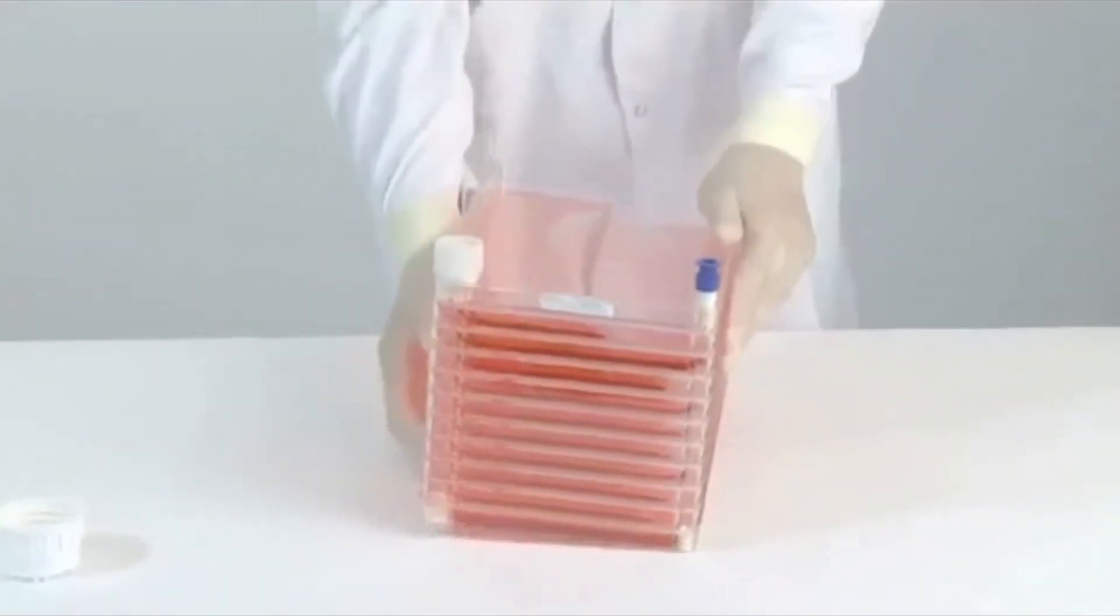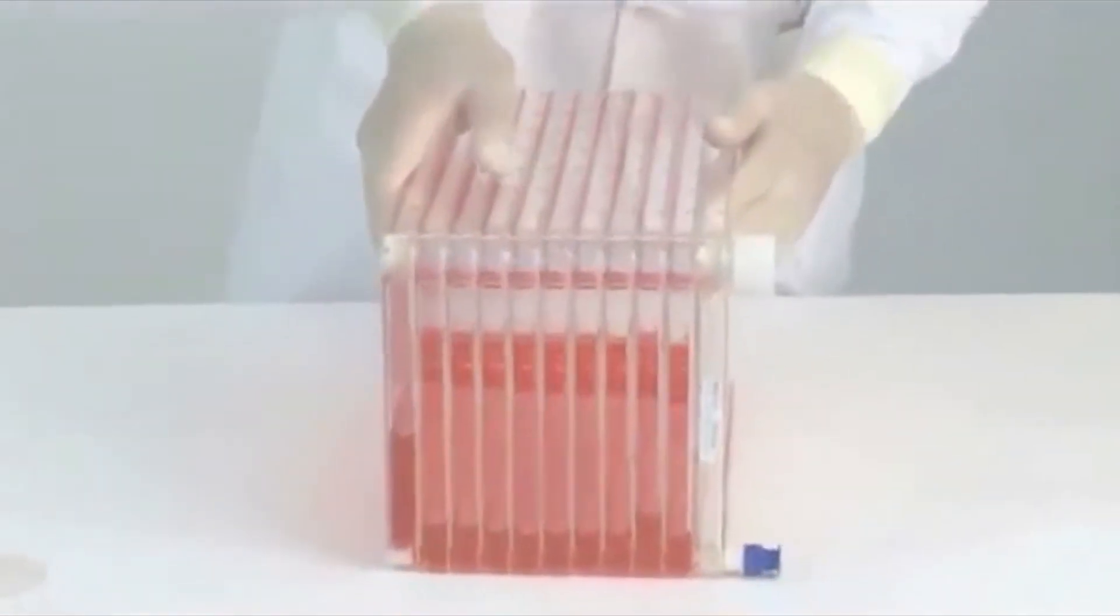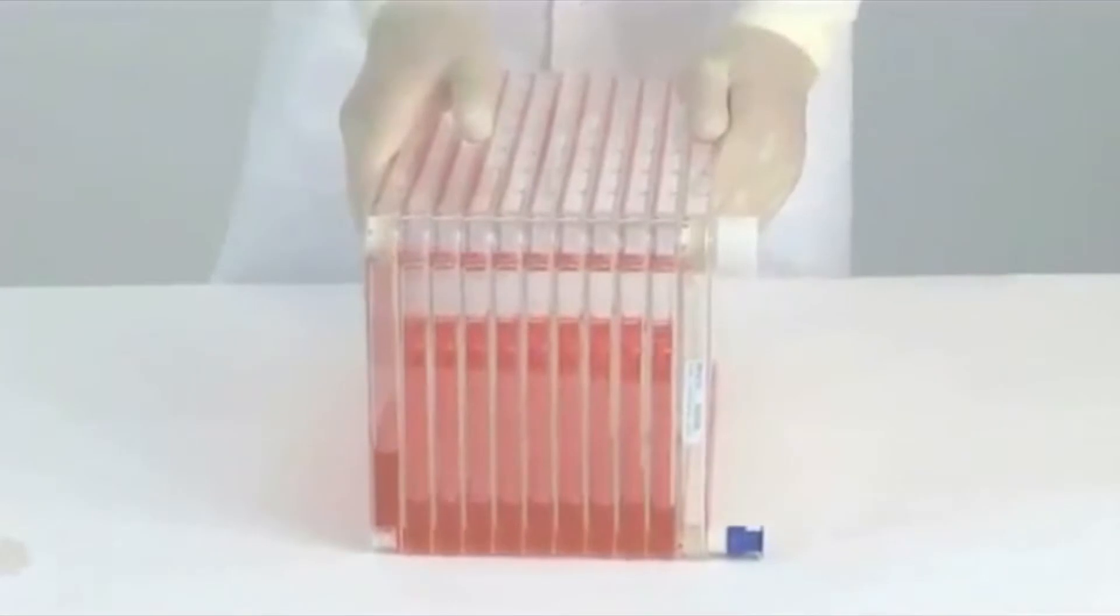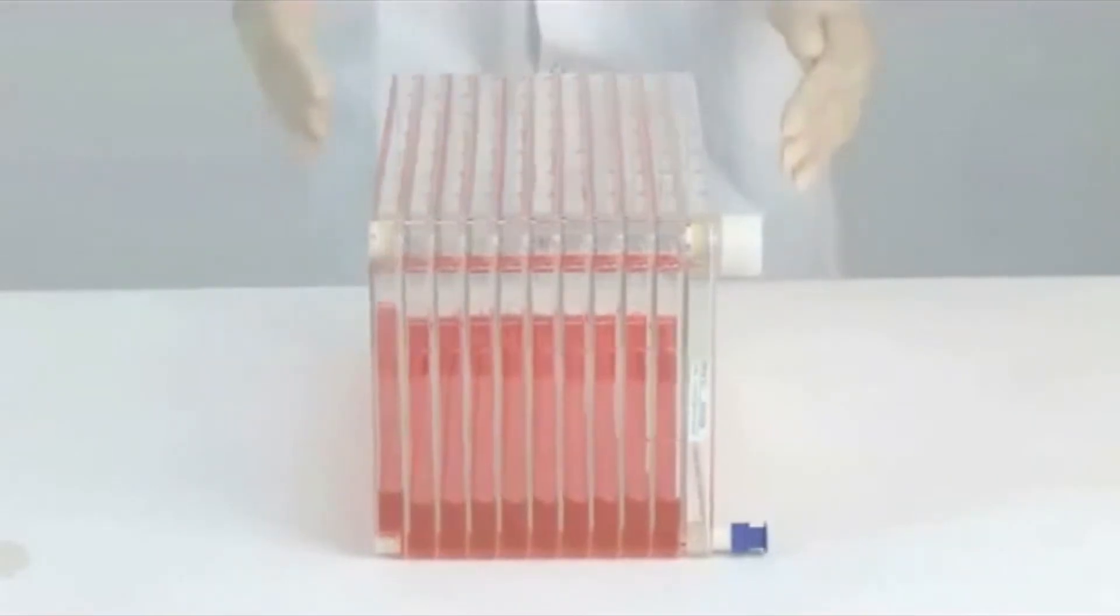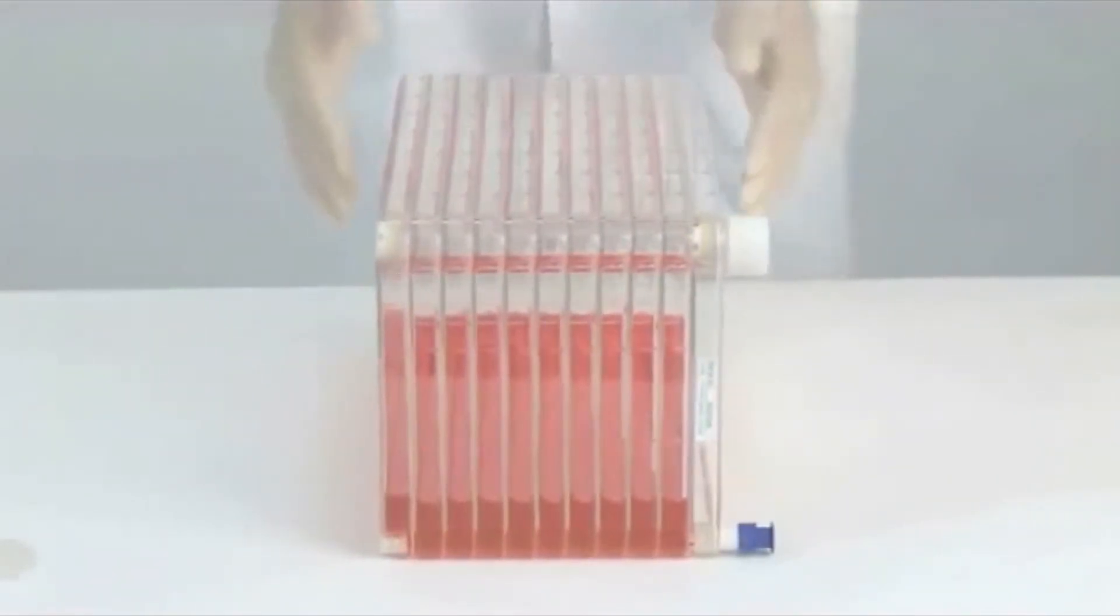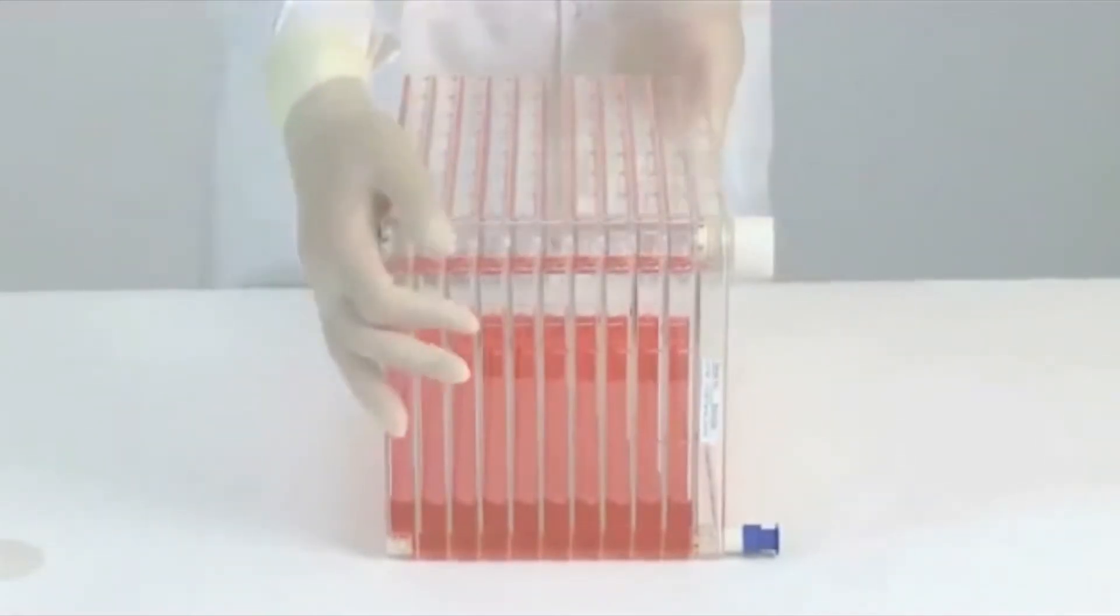Individually wrapped replacement closures are available from your NUNC distributor. To equilibrate the media level in all chambers, place the cell factory system on the long side with the small port. The white vent closure port should be at the top. This orientation is important as it will prevent the vent filter from getting wet.